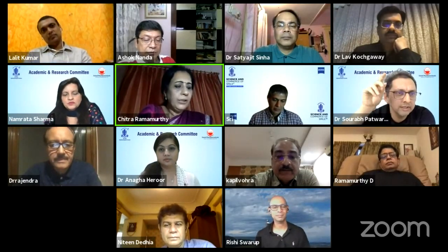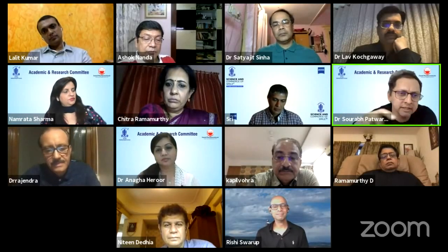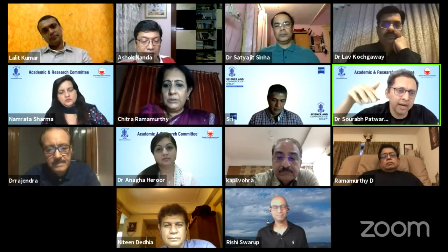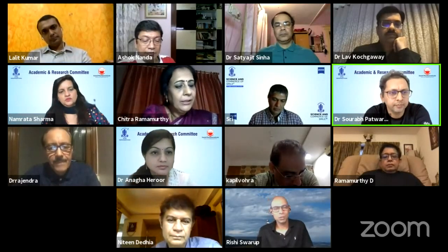Dr. Swarup had something to say? Yeah, one small trick which I use sometimes is that many times these opacities have certain areas which are clearer, and we can use parallax. So we can tilt the eyeball a little bit and see through that area. I think that also helps in some. Good point. Thank you very much.